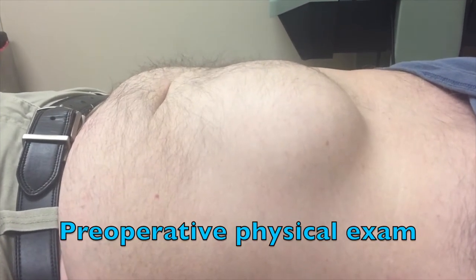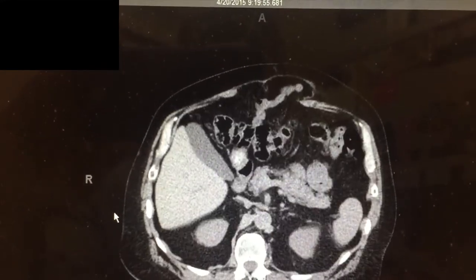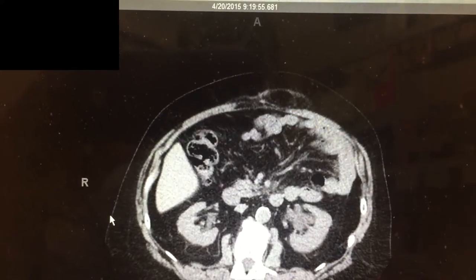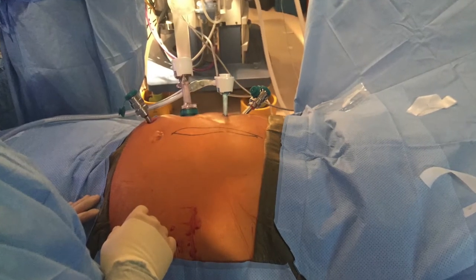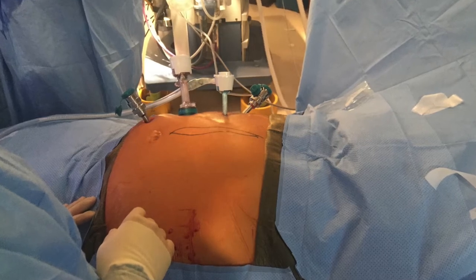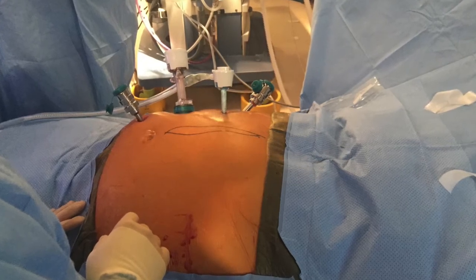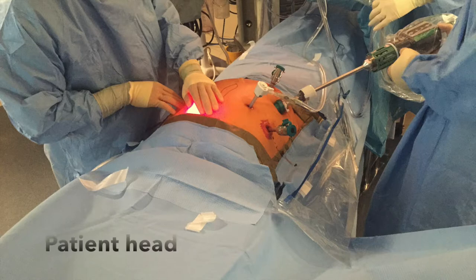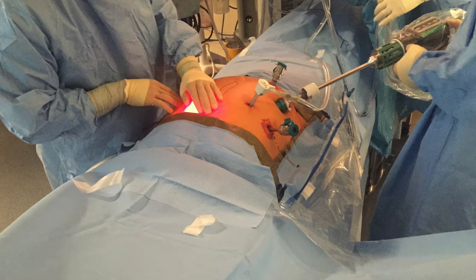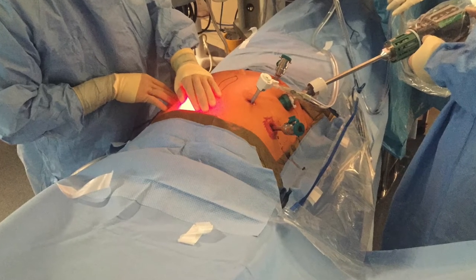Here is preoperative video of the subxiphoid hernia, which is moderate in size. This is the CT scan of the abdomen and pelvis. After evaluating access, I determined that one trocar was not lateral enough, so I used it as an accessory trocar, which we typically do not use. All the robot trocars are separated by 10 centimeters and somewhat favor the left upper quadrant, given the subxiphoidal position of the hernia defect.